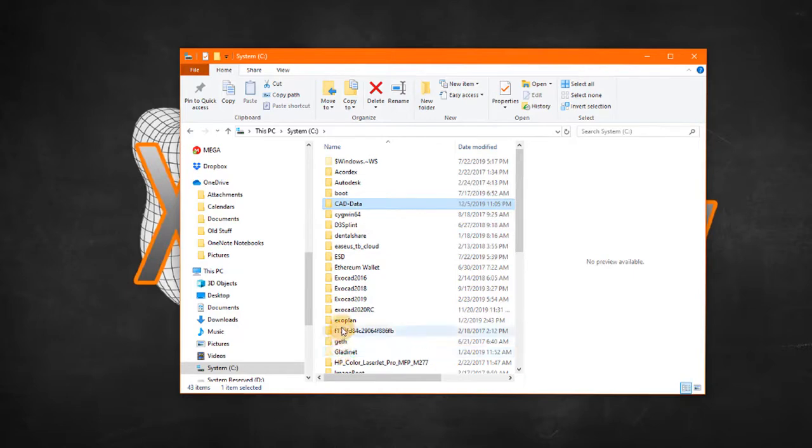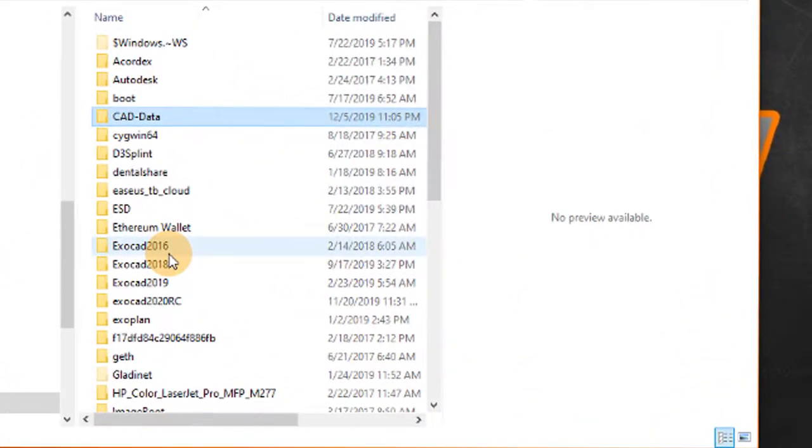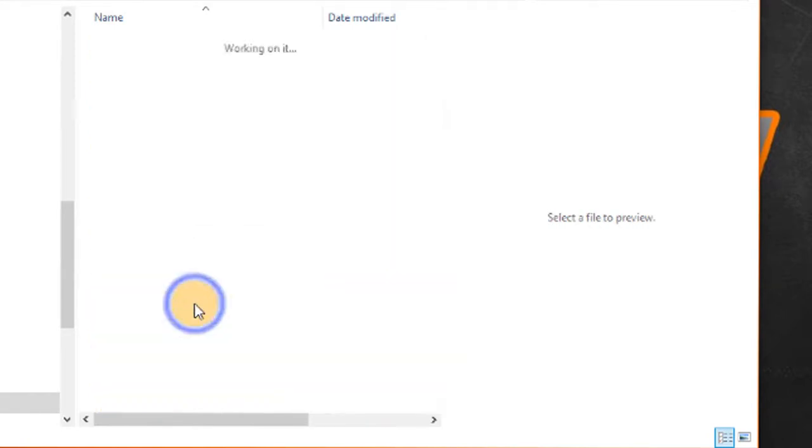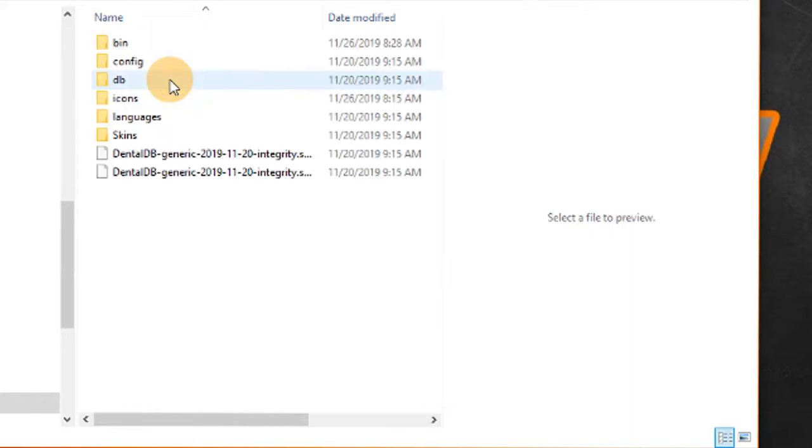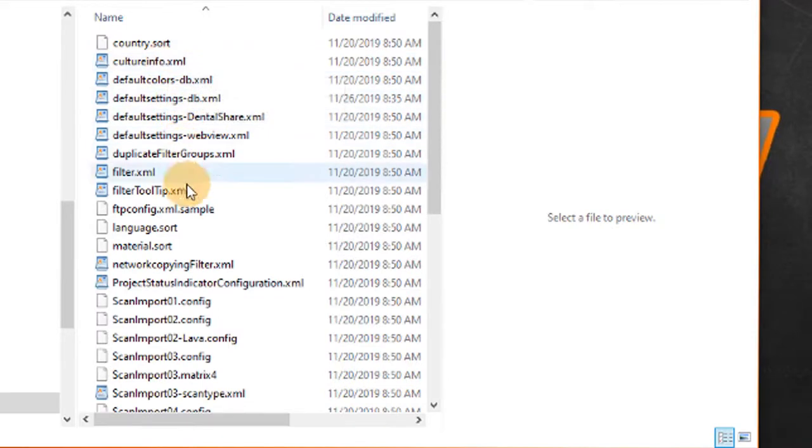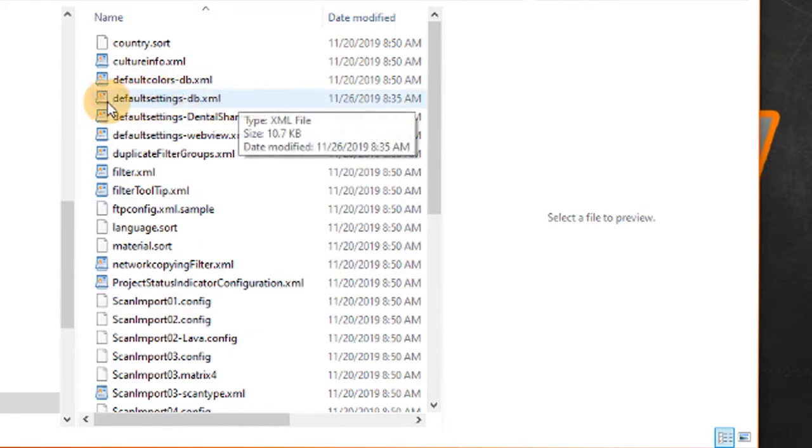First what we do is we go to our ExoCad installation that we're going to change. So in this instance let's just do the beta version of version 2.4, the dental DB folder and I believe config. In there we're going to go to default settings dash DB dot XML.